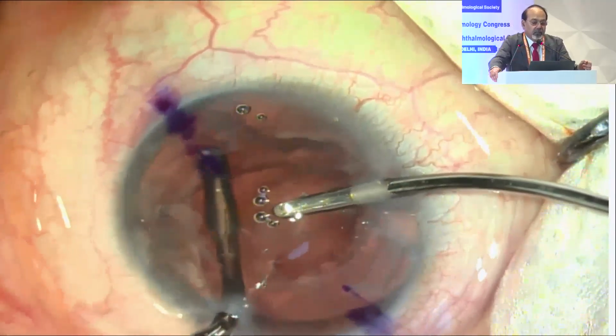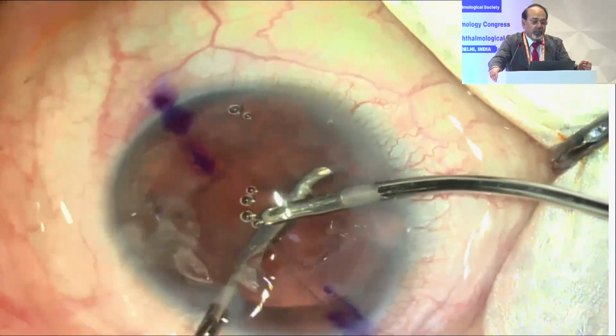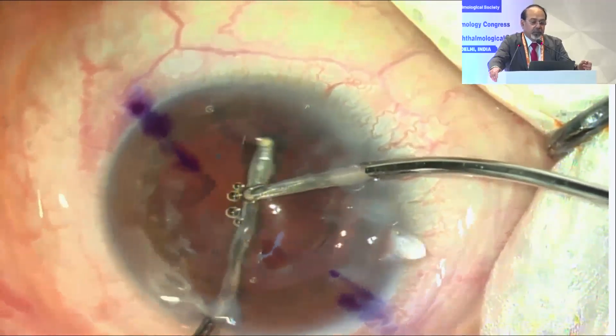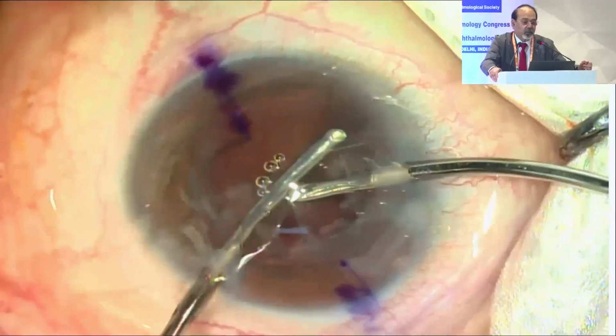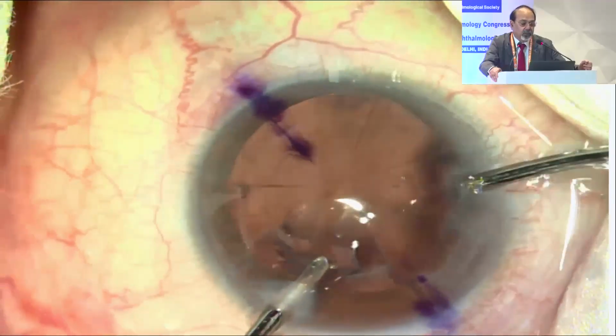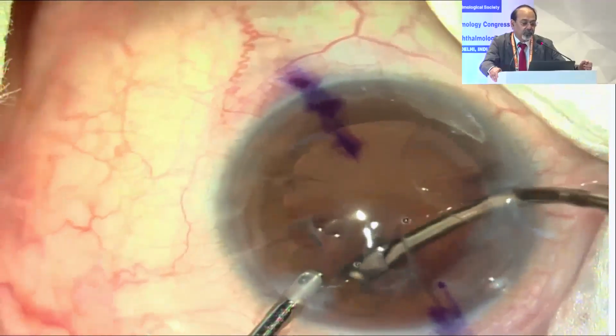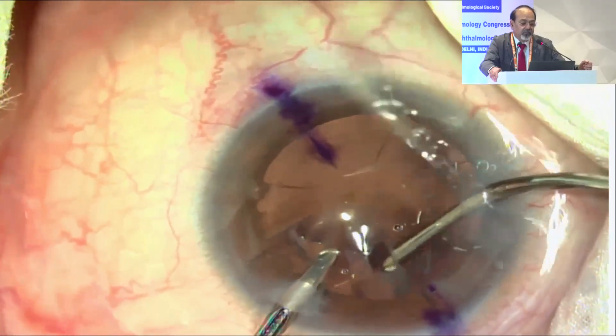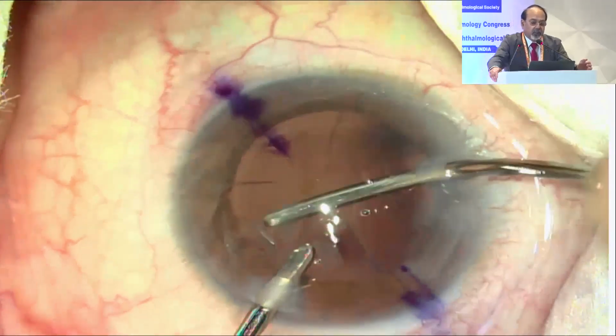And then removal of the epinucleus is not very difficult. The only thing which I wanted you to notice was that I rotated the nucleus so that there were no corticocapsular adhesions. These are removed very peacefully with the rotation of the nucleus.